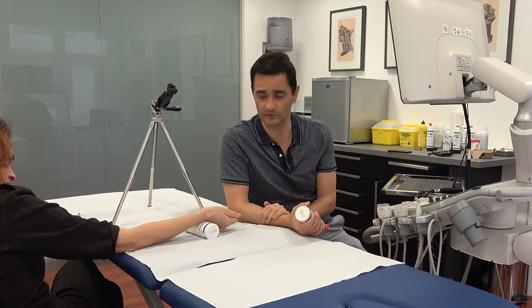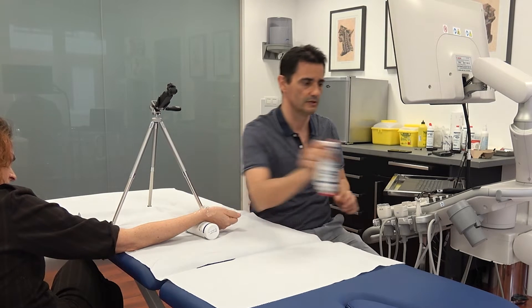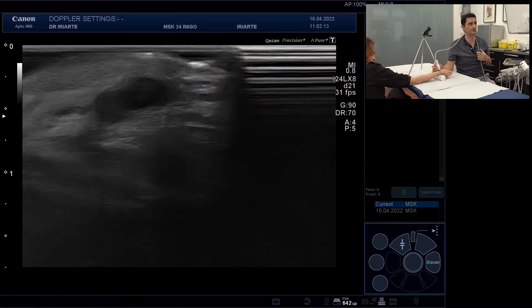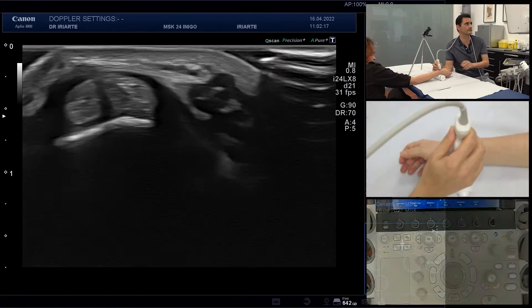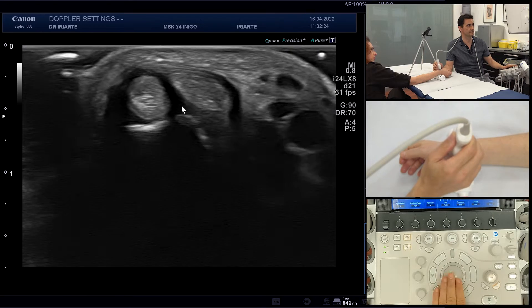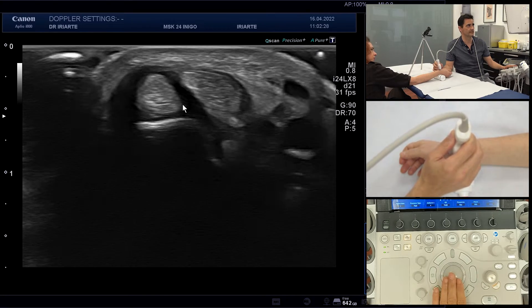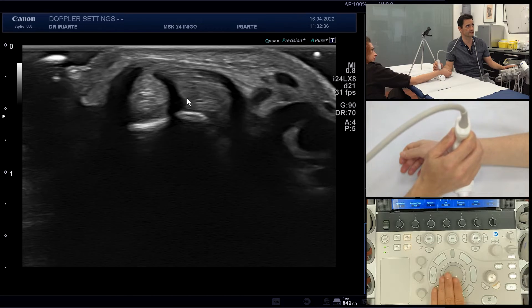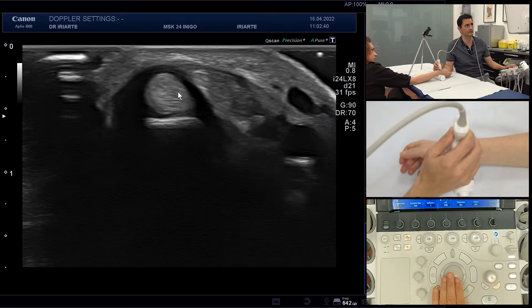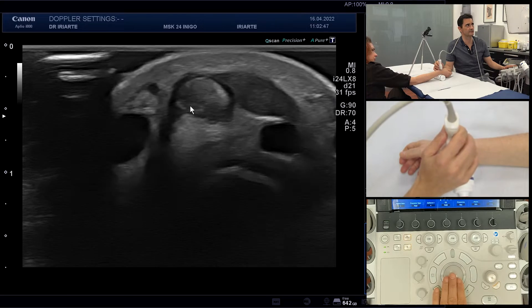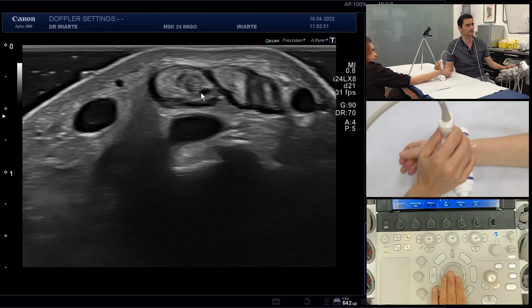If you want more information, take a look at mskroom.com. We are going now to talk about the Doppler, and we have this patient who has De Quervain's tenosynovitis with affection of the first compartment. This first compartment is separated by a wall which isolates the extensor pollicis brevis and the abductor pollicis longus. In this case, the affection is only of the extensor pollicis brevis.